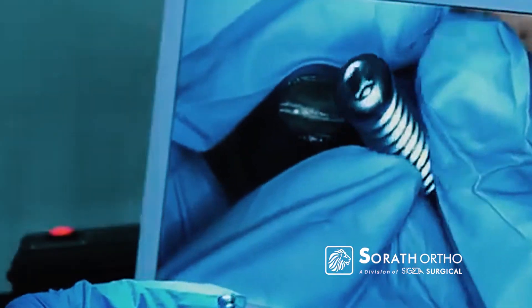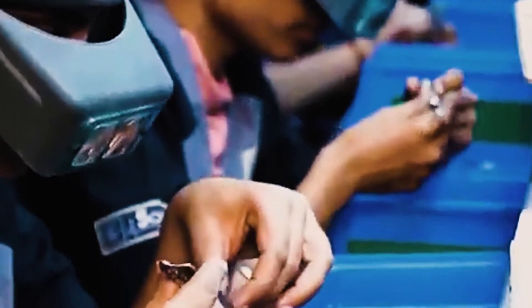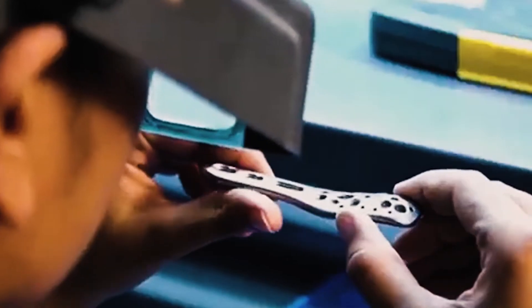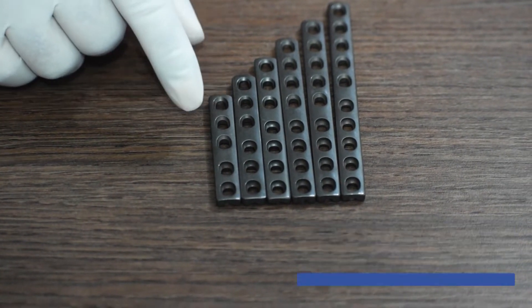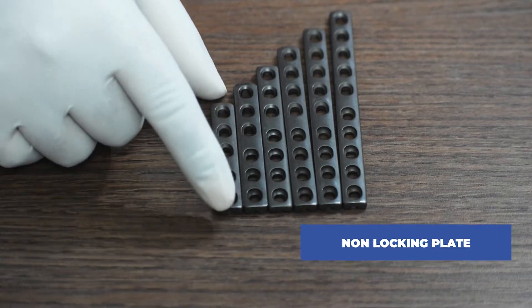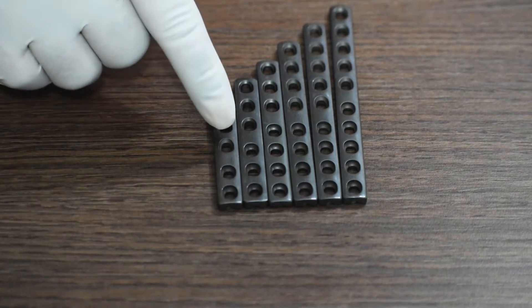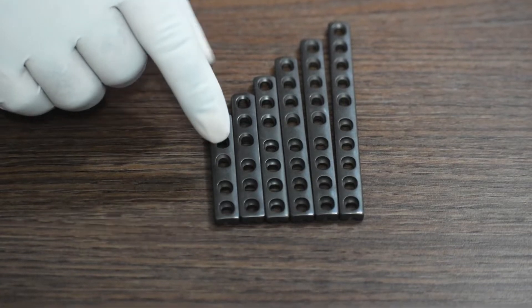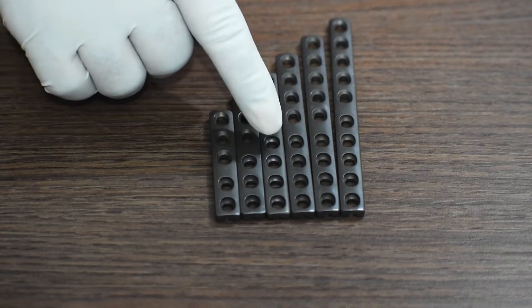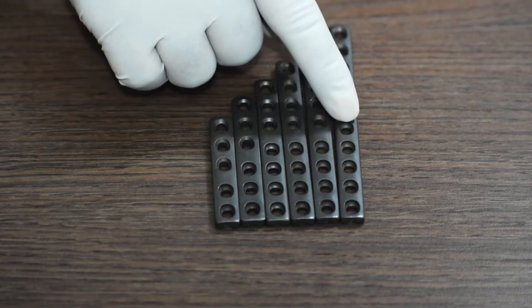Let us see what the dynamic compression plates look like. This is a dynamic compression plate — it's an unlocking plate, available from five hole to ten hole with a difference of one hole for each plate: five holes, six holes, seven holes, eight holes, nine holes, and ten holes.